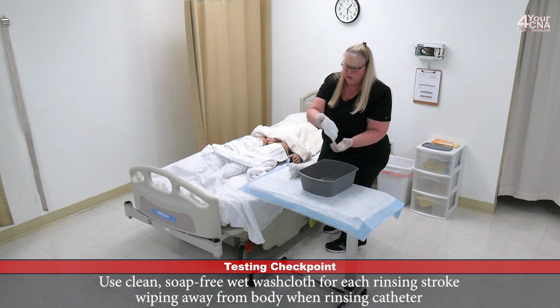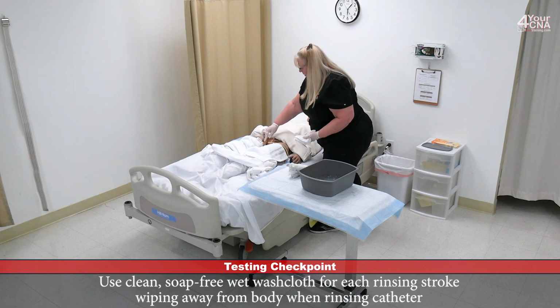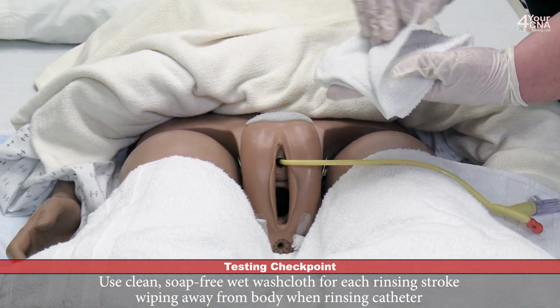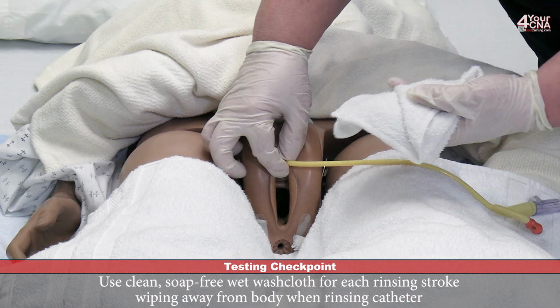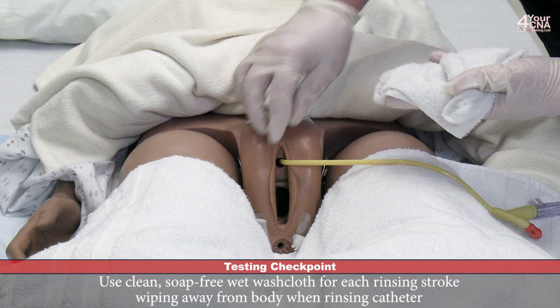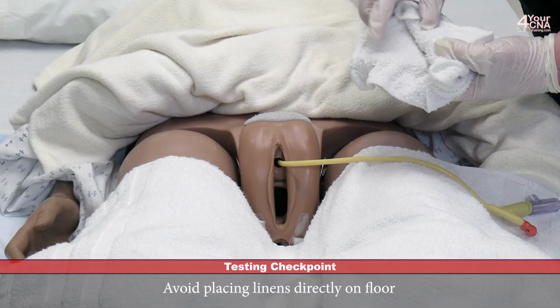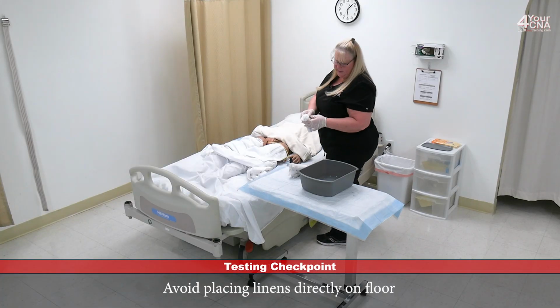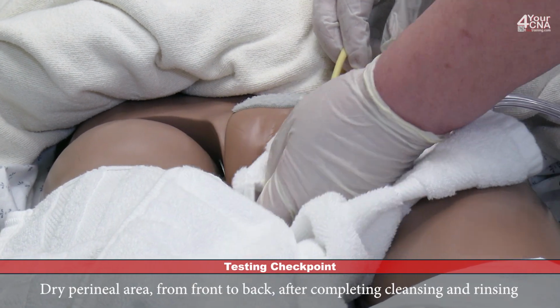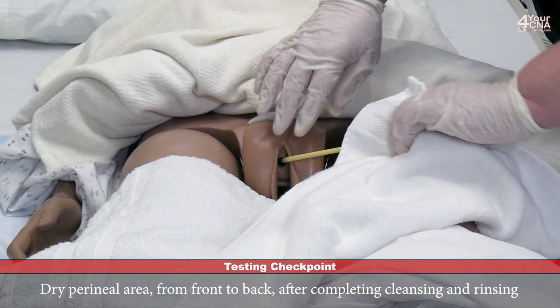I'm going to wring the rinsing washcloth out thoroughly, hold it in the diamond shape in my hands, hold the catheter where it exits the body, wipe the washcloth around, and rinse going down the catheter. We'll fold that leaf, rinse 2, fold that leaf, rinse 3, fold that leaf, and rinse 4. We'll set that aside. Whatever we rinse, we dry. So we'll dry the peri area top to bottom and the catheter tubing.